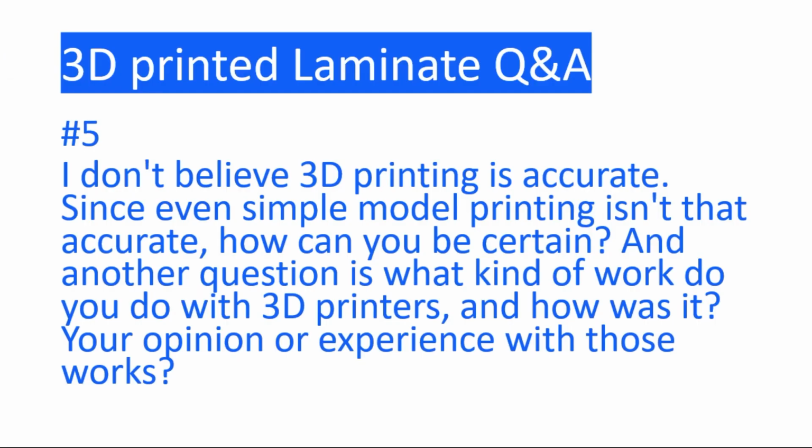Number 5. I don't believe 3D printing is accurate. Since even simple model printing isn't that accurate, how can you be certain? And another question is, what kind of work do you do with 3D printers? And how was it? Your opinion or experience with those works?